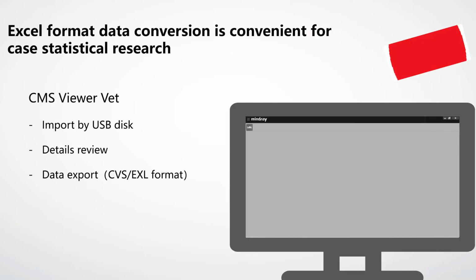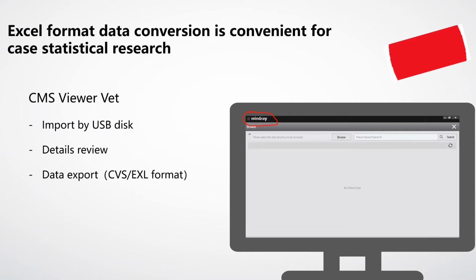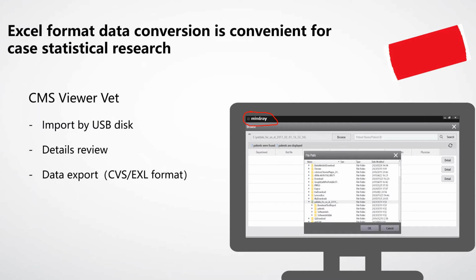And then we can provide the CMS viewer for you to view all those data on your computer. You can plug in the USB disk, then click the menu here, I mean the My icon. Then you can see the menus pop up, and you can select Browser. After you enter the Browser menu, you select the patient's data from the USB key.